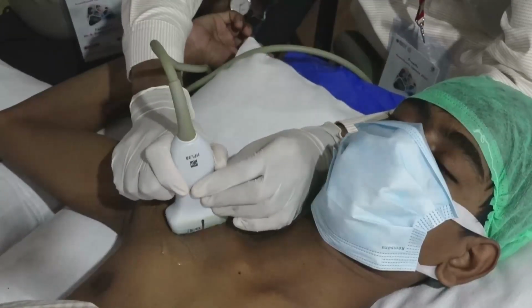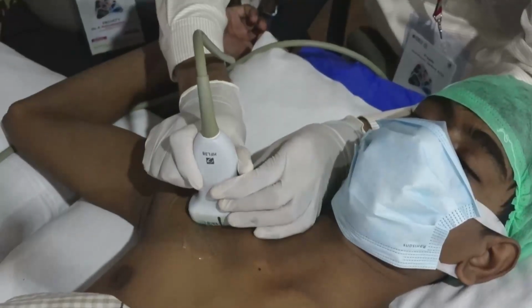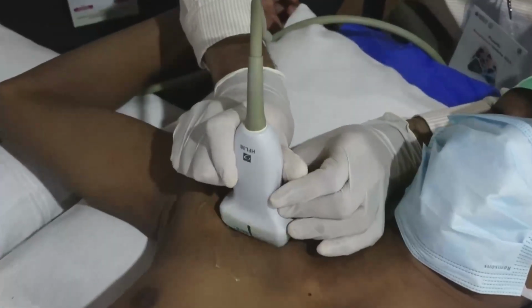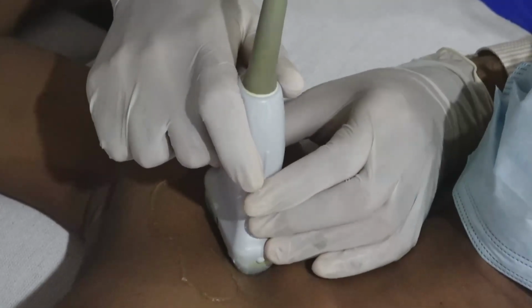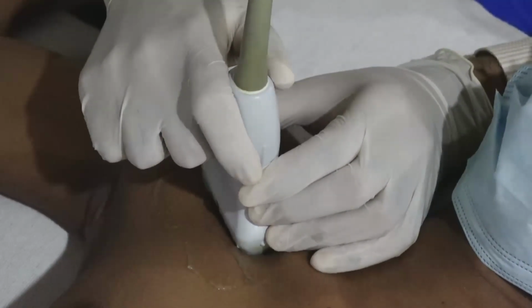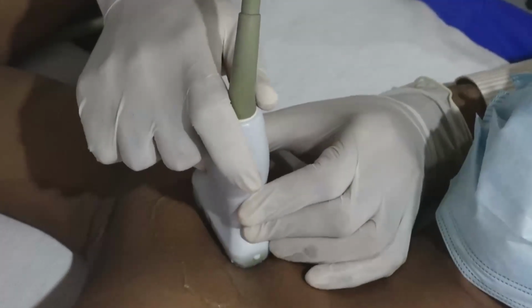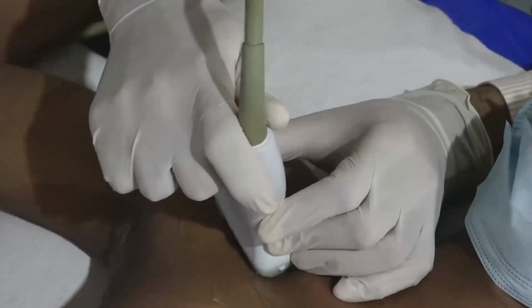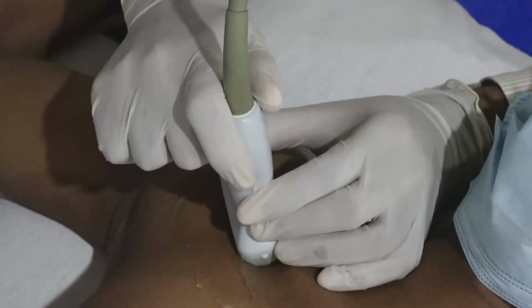So if you trace the cords again, this is our costoclavicular component.